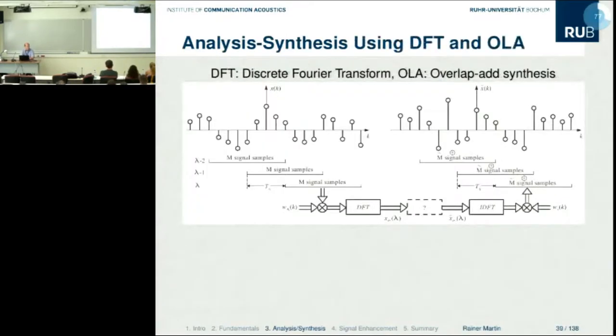So what I want to do is to show you a design that we developed some years ago, which also gives you a lot of flexibility and leads to nice trade-offs between computational efficiency, latency, frequency resolution, and so on. It's all based on what we call the overlap-add analysis synthesis system, which you might have seen before.